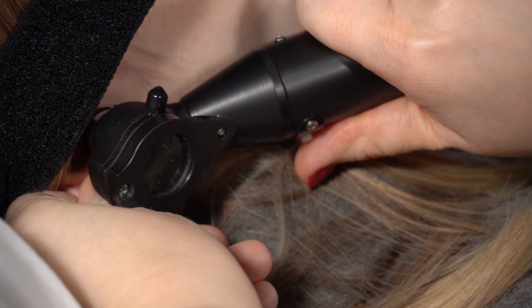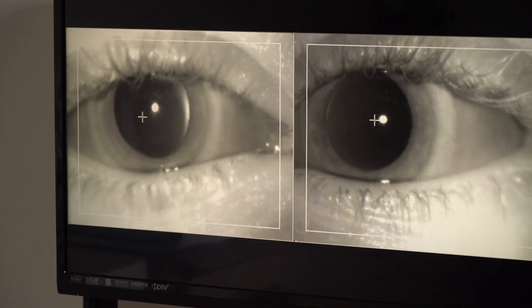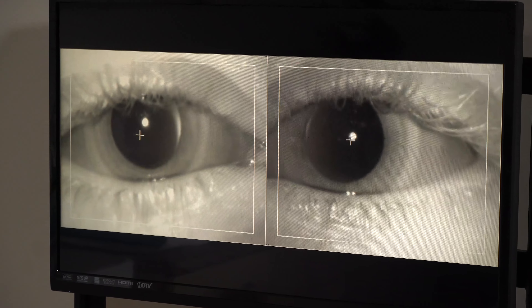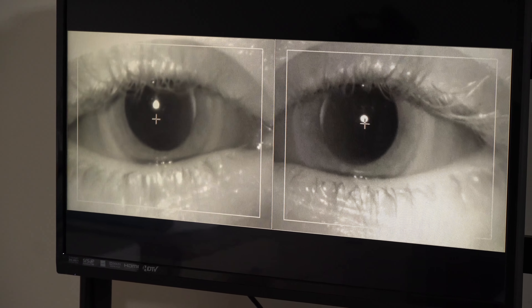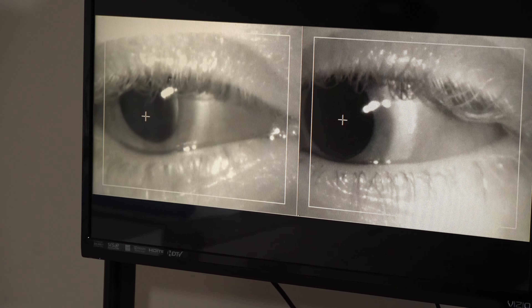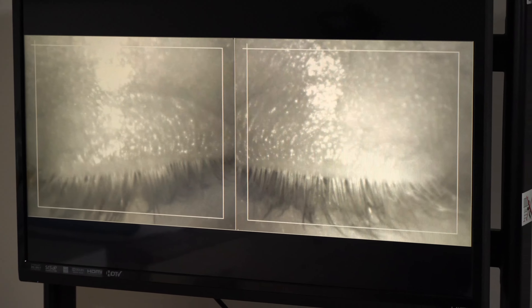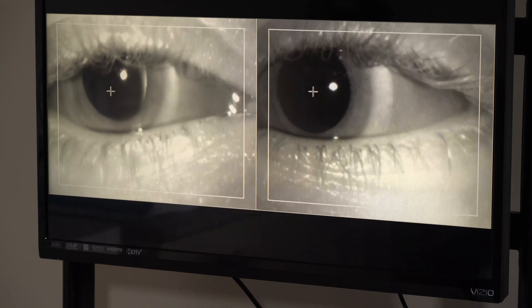It looks like your eyes are starting to move — try and keep your eyes open for me. We might get some glamour shots of the TV screen once it gets going a little better. The eyes are pulling to her right and having a little corrective jerk to her left — that is what nystagmus is, and that's what we're testing in this test. Since the corrective jerk is to her left, she has left-beating nystagmus, and it means she feels like she's spinning to the left.